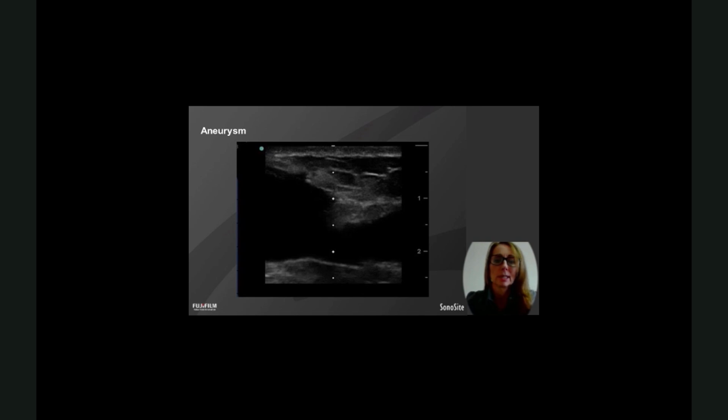The reason why we captured this image was that the staff were being very good and trying to move their cannulation spots, and because the vessel was quite deep in some areas, they'd been puncturing the aneurysmal bit and wanted to move a little bit higher up. They punctured assuming that that would also be shallow, but were just not able to hit the vessel and weren't really sure what was going on.